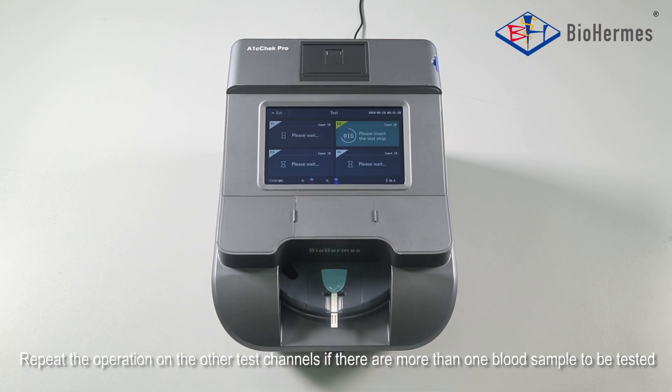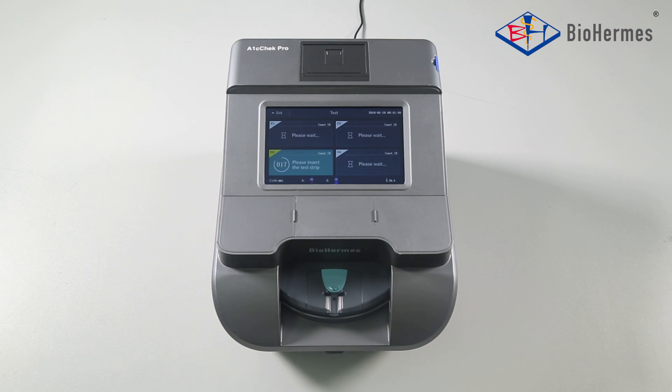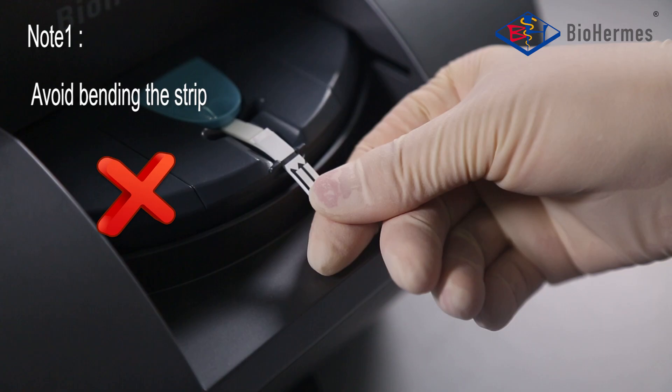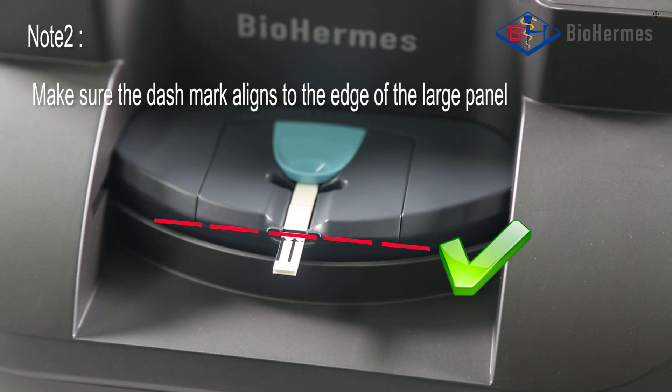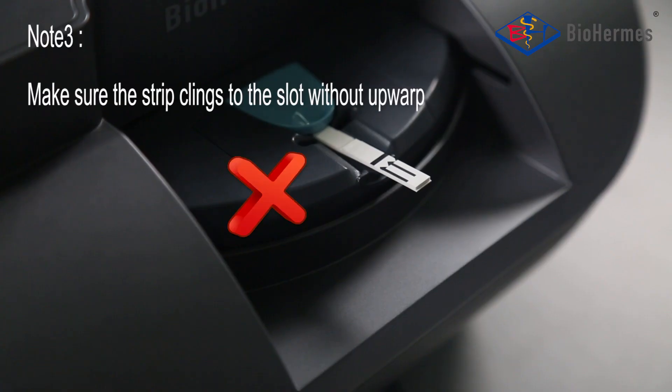Repeat the operation on the other test channels if there are more than one blood sample to be tested. Note: 1. Avoid bending the strip. 2. Make sure the dash mark aligns to the edge of the large panel. 3. Make sure the strip clings to the slot without upward.